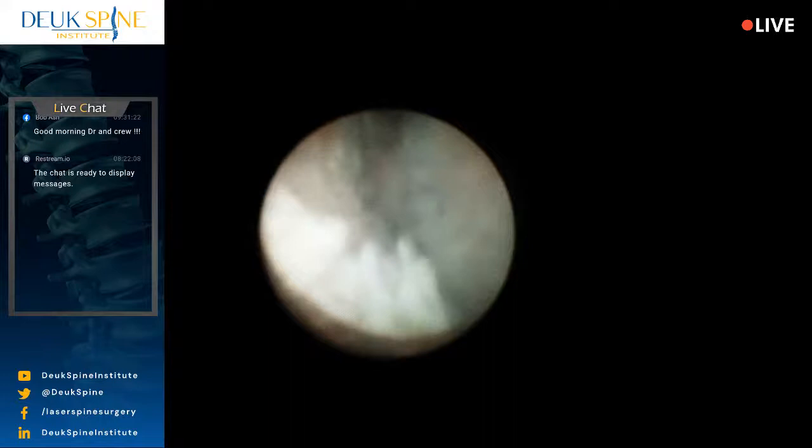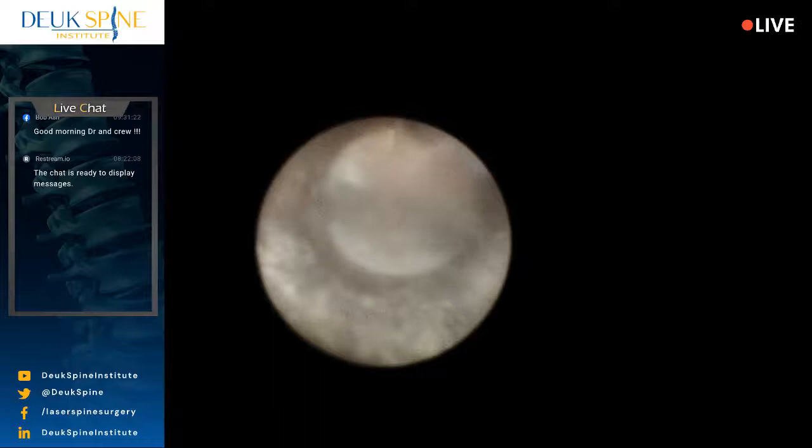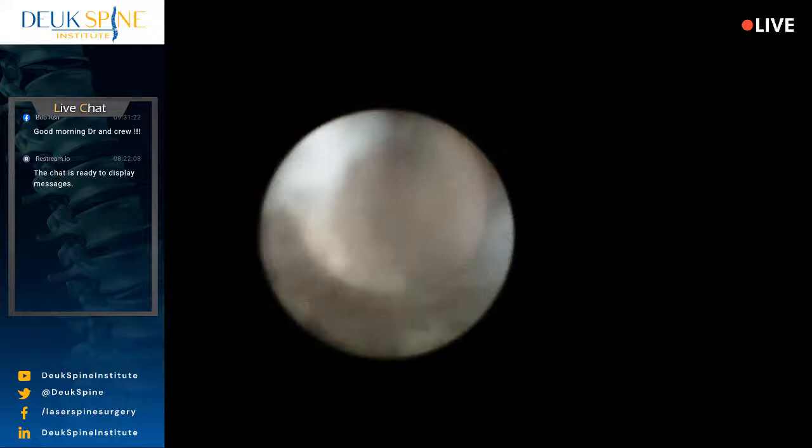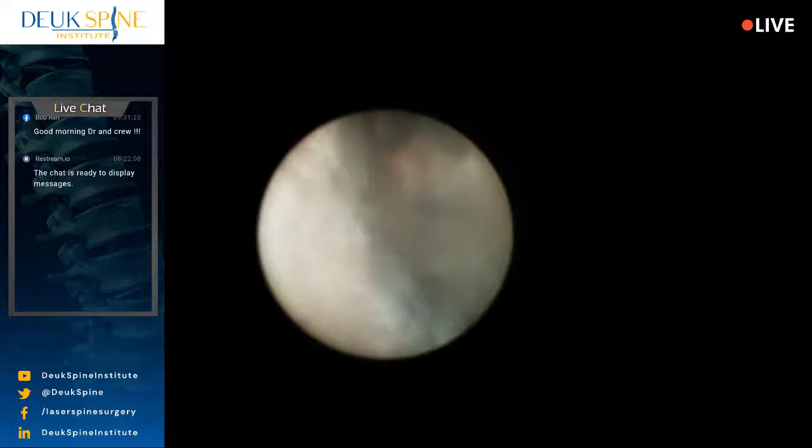Back down here is where the herniation is. And it's pretty grungy. In terms of arthritis, it creates a reaction in the bone and in the ligaments and in the tendons and in the capsule. Basically, the body's response to chronic inflammation is to form this abnormal tissue. And this abnormal tissue can press on nerves and it can be very painful. So that's what we're here to remove, is this abnormal tissue.